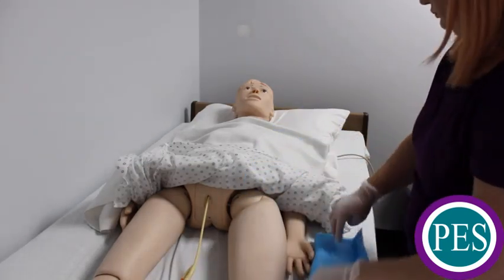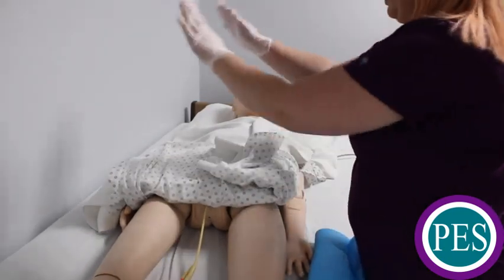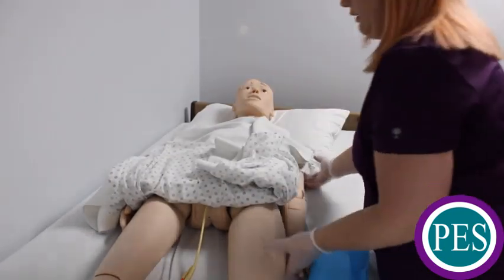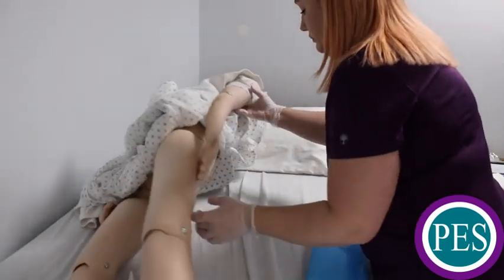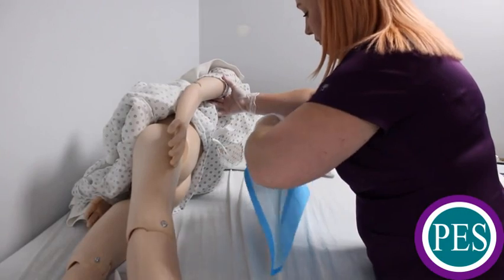Place a barrier under the bottom of your resident to protect the bed and to keep the bed dry. Remember when exposing the area surrounding the catheter that you're only exposing the lower half of the resident's body.